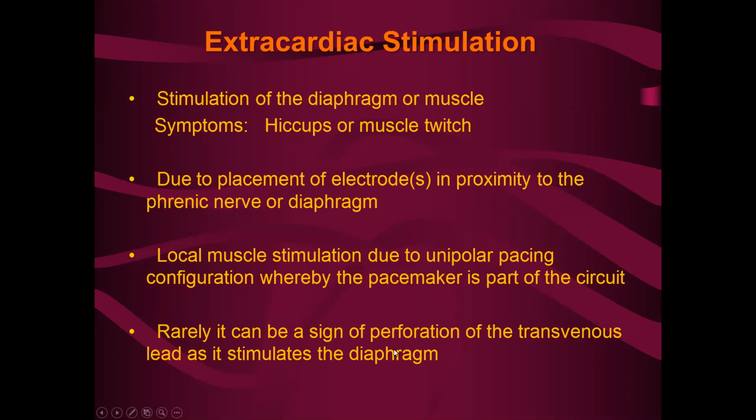And then very rarely, if a patient suddenly starts to get hiccups and didn't have this before, it could be that the transvenous lead may have perforated. So if the transvenous lead was positioned down in the RV apex and perforated, then it could now be capturing the diaphragm. So we would need to do more investigation.